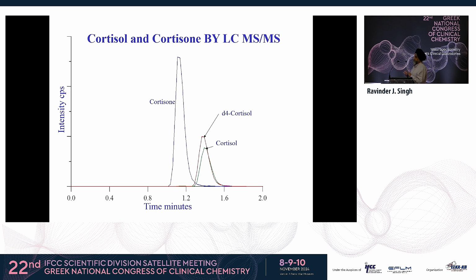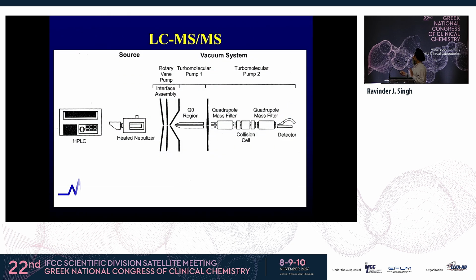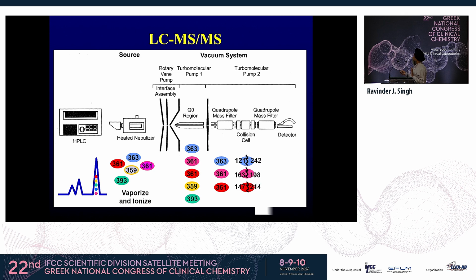Our sensitivity is equally good. We can provide good specificity. We can separate cortisol, cortisone. Of course, mass spec cannot resolve the isobaric compounds that came up in the last discussion with Bruno's talk, amino acids. And steroids do have that problem also, some of the steroids, but then you rely upon your chromatography. But for cortisol, we were very successful here. I think I'm going to pass on this slide, as you are all experts in how the triple quad has helped us in reducing the interferences.